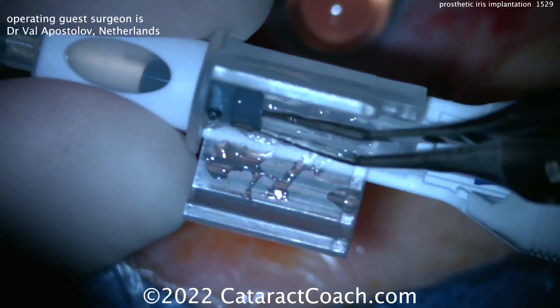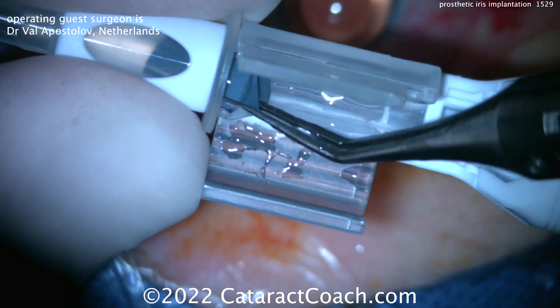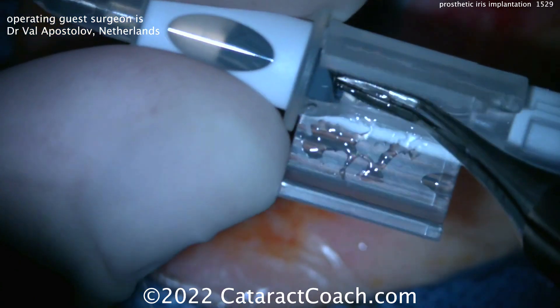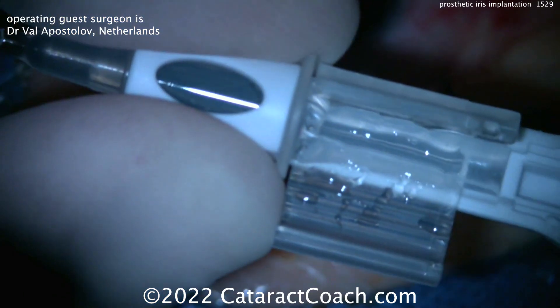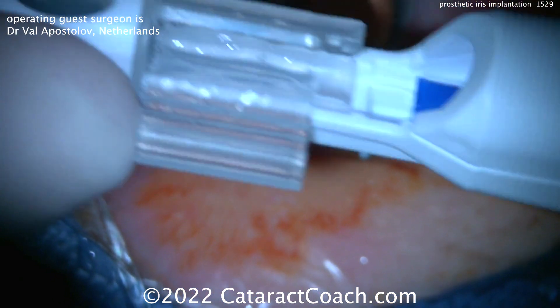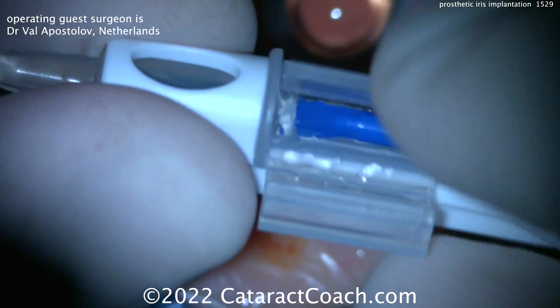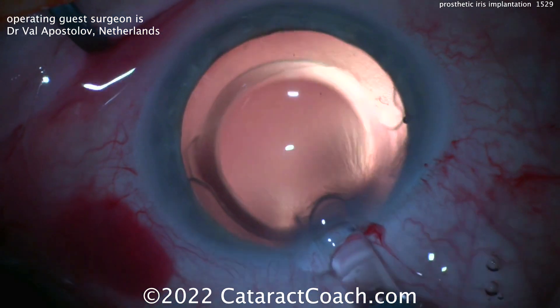...this device is going to have a diameter at least as much as the corneal diameter — say 11 or even 12 millimeters — so quite large. Because of that, it's a challenge to get it in the capsular bag. You can stain the capsule a little bit with Trypan Blue Dye, and that can help visualize the capsule during the procedure.